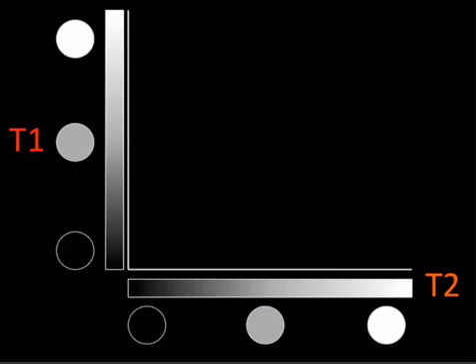So if you start out here, right in the middle on the far edge, let me explain the graph first. We've got one axis that's T1 and the other axis that's T2. The first one that you come to is T1. Another way to remember that, so you don't get your axis mixed up, is that a 1 sort of looks up and down, so this is up and down, and then the other one is the other one. And then black, ISO, and then bright in that direction.